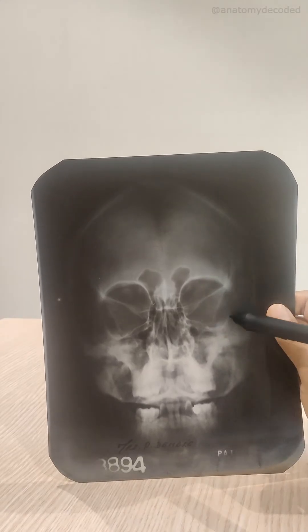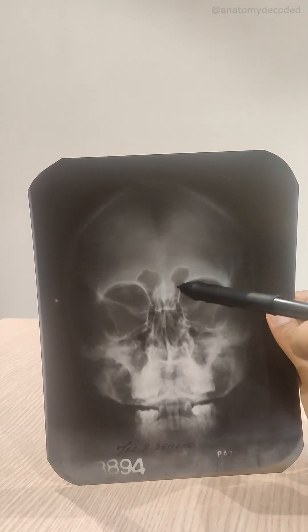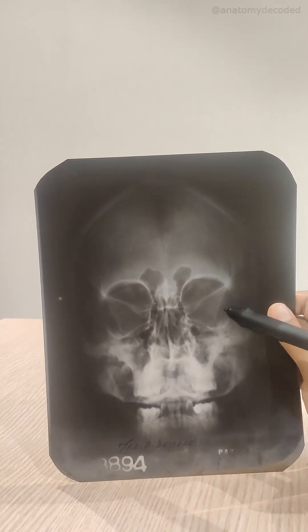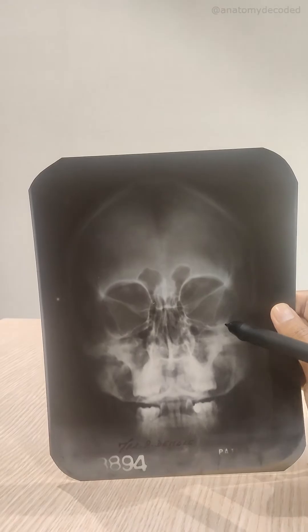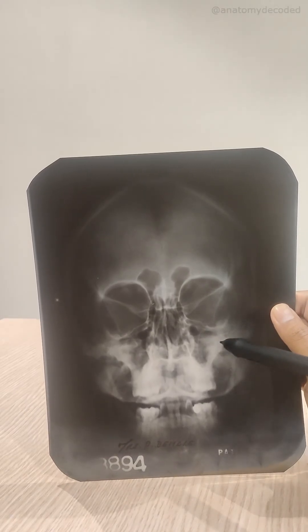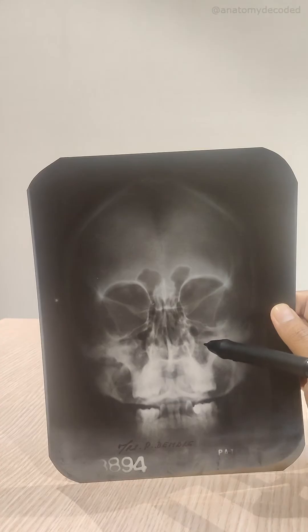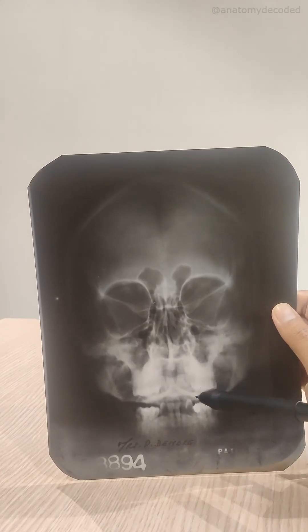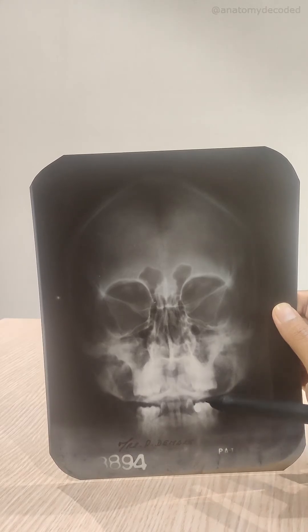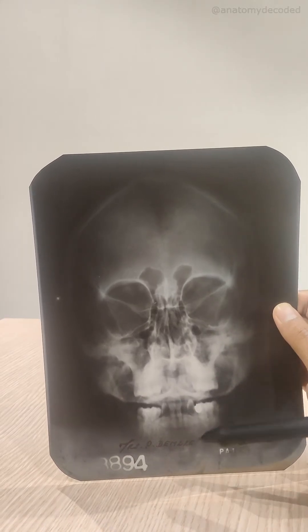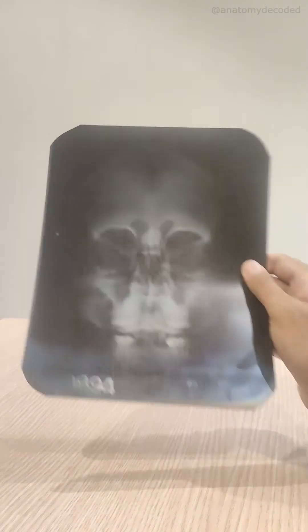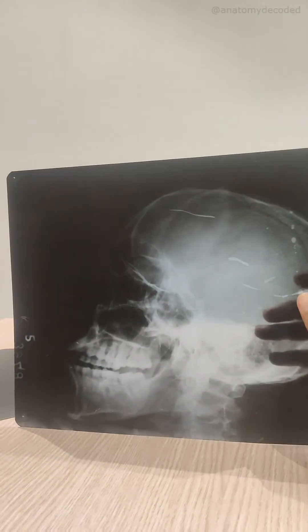This black shadow is not of any air sinus — it is of the orbit, and the orbital margins are visible here. The white shadow we can see is actually the petrous part of the temporal bone, the hardest part of the skull, which gives a radio-opaque shadow. Then here is the maxilla with the upper teeth and the mandible with the lower teeth, all visible in this plain skygram.